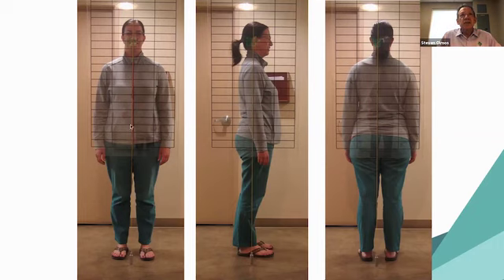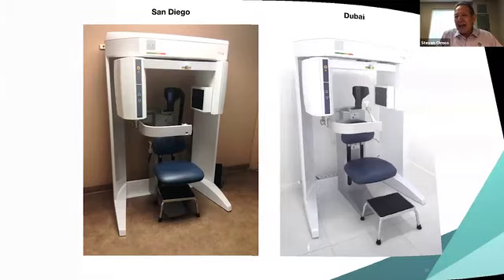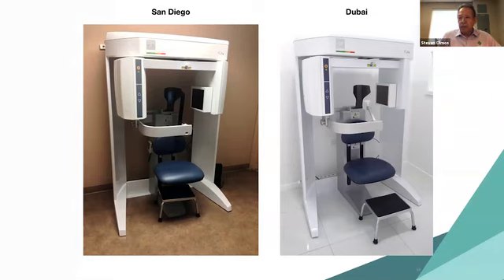And so now you can see if we split her hips, this goes right through her nose, and we've uprighted and aligned her in this process. Sometimes it's easier to see side by side, so I'll show you that here she's going through her eye. This line goes right through her nose. So these are ways that we can document how the jaw joint affects the whole body in posture.